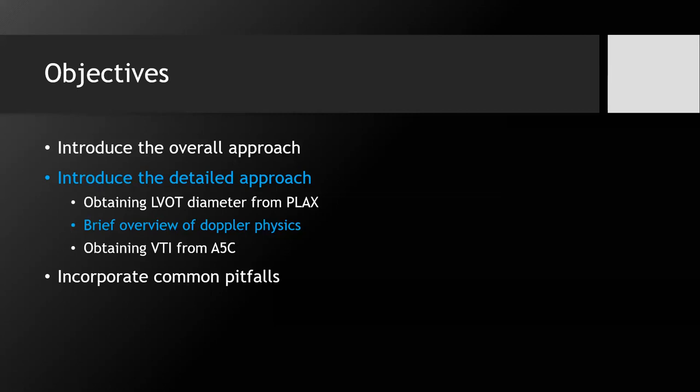Okay, so getting the surface area of that, or not the surface area, but the area of the circle part of your cylinder, is pretty straightforward, I think, from the parasternal long axis view. But how do you get the height of that cylinder? Now, remember that the blood is not flowing through and creating an actual cylinder. It's just creating a cylinder as it's going through the LVOT.